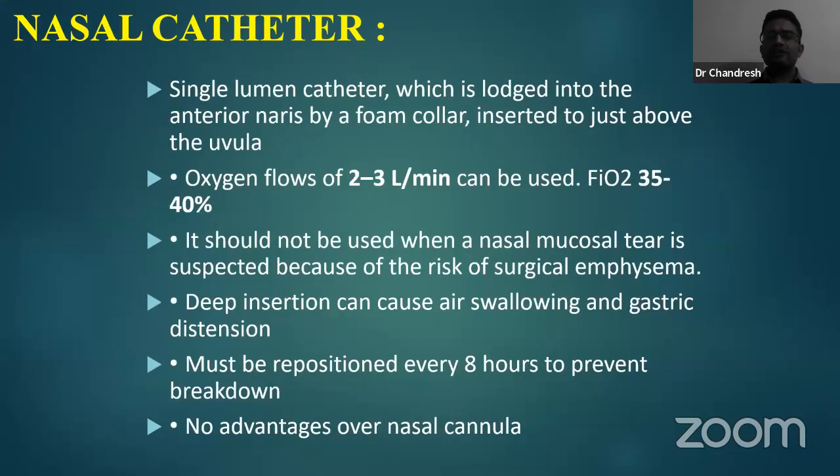It should not be used when a nasal mucosal tear is present, because there is a high risk of surgical emphysema, as it is a little bit invasive. Deep insertion can cause air swallowing and gastric distension. That's why every 8 hours it should be repositioned and the position checked. There are no advantages over the nasal cannula as far as the nasal catheter is concerned. Next.